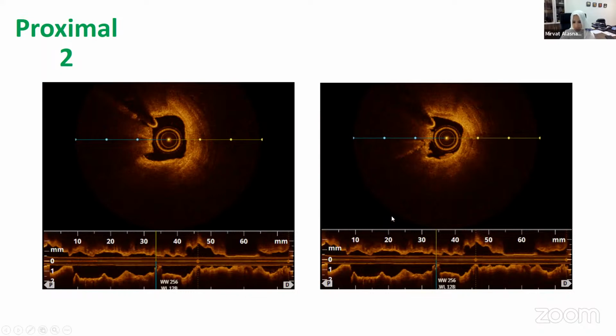And then if you look at the right hand, I'm moving even further into the vessel. So you see I'm coming closer to 35, and you now start to see this eruptive nodule that is definitely encroaching on the lumen even more. It's right next to, coming closer to touching the catheter that's in the center, and right next to the wire that we have in there.